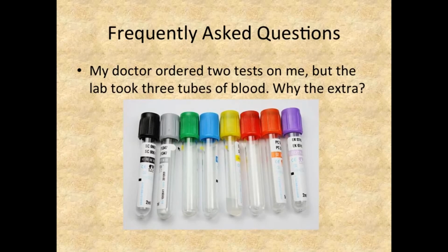Very high volume tests like blood glucose are done in every lab, and they're done each day, often multiple times during the day. In a very large lab, it may be an almost continuous process where they're continuously running blood glucose tests. So as the samples come in, they're placed on the analyzer, they're analyzed, the results are confirmed, and the results go out oftentimes within an hour or 2 after that sample comes in. And so those will be very rapid turnaround times. Your clinician will have those results the next day.